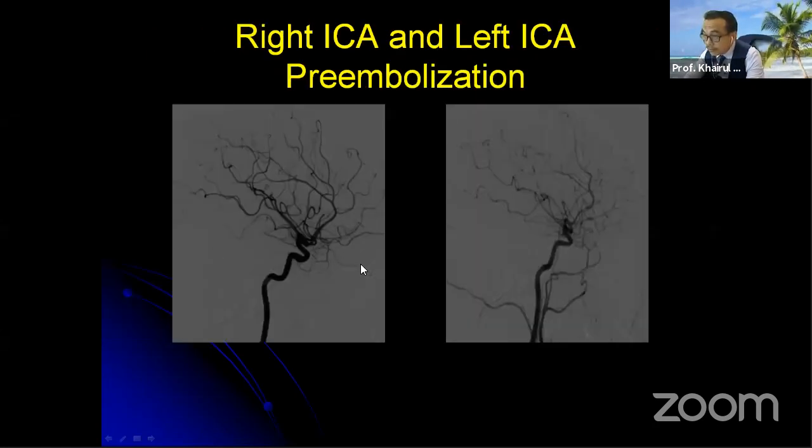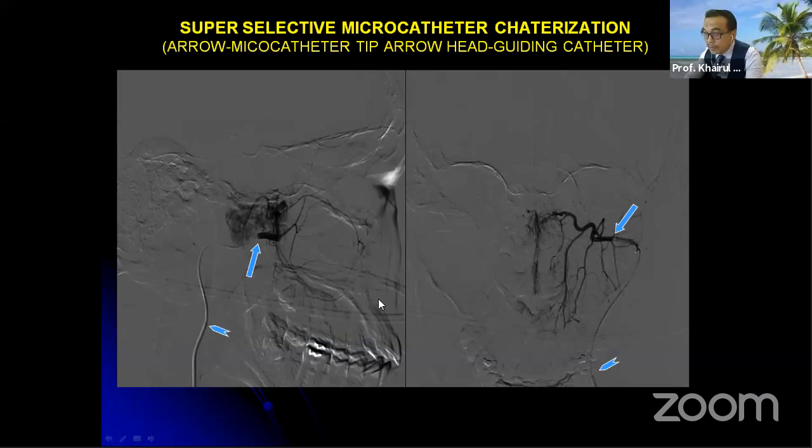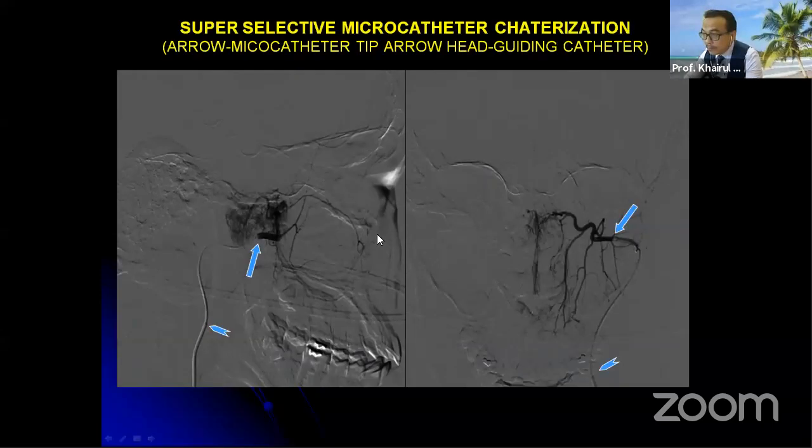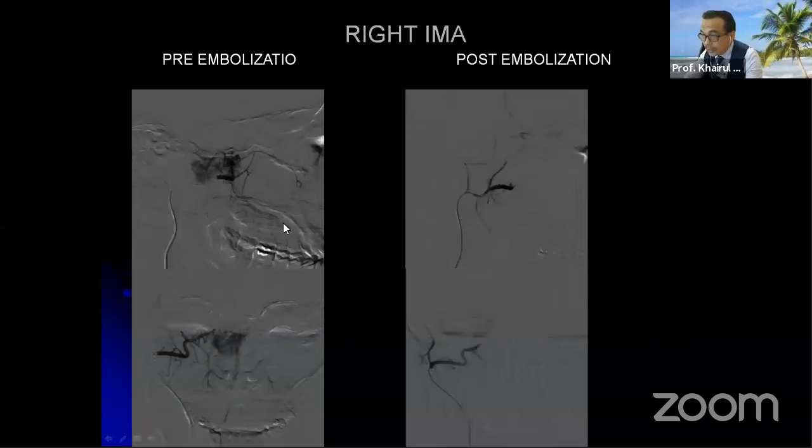Like in this case, this is a 17-year-old boy with pre-op juvenile angiofibroma. We don't see the ophthalmic artery in this radiograph. When you don't see any ophthalmic artery in the scalp, and you don't see a choroidal blush, you must be very careful when you do the external carotid artery to look whether there is any possible meningo-ophthalmic branch, even though we wish to place the catheter very far distal into the internal maxillary artery to obliterate it for the pre-op embolization.